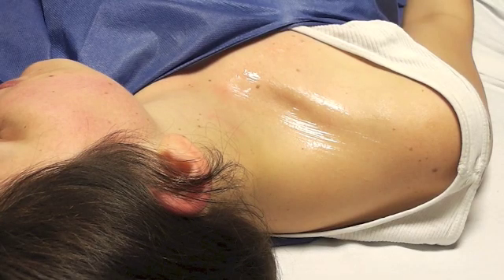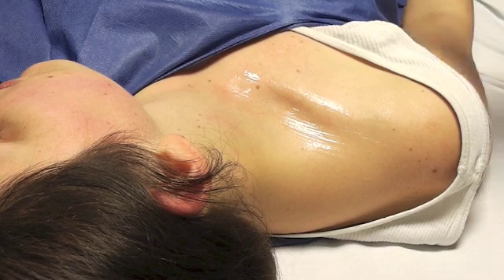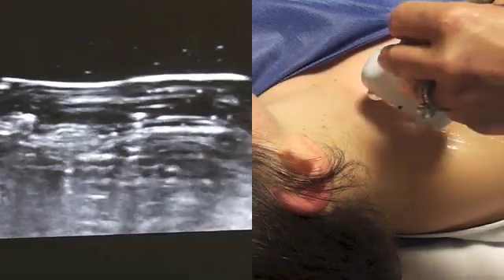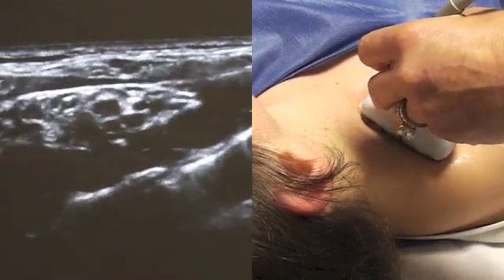For a supraclavicular block, the first thing we do is position the patient. This patient's arm is adjacent to her side and her neck and head are turned opposite the side we're going to block. We're looking for the groove right above the clavicle, and this is the image you get in almost every patient, no matter how big or small they are, as you place an ultrasound probe right above their clavicle.